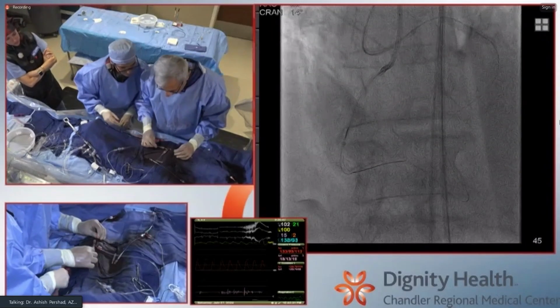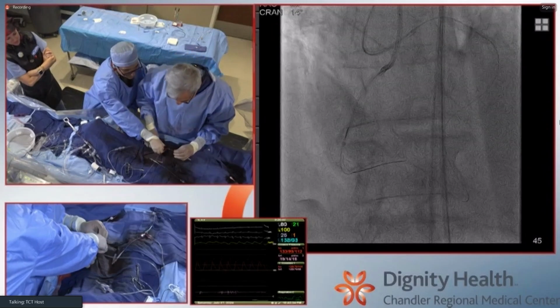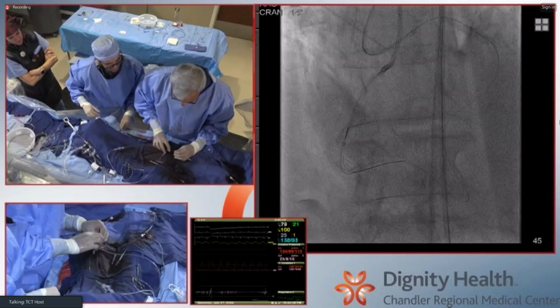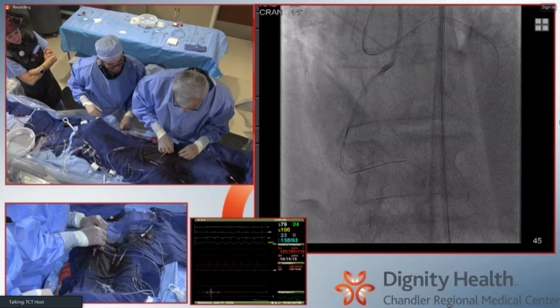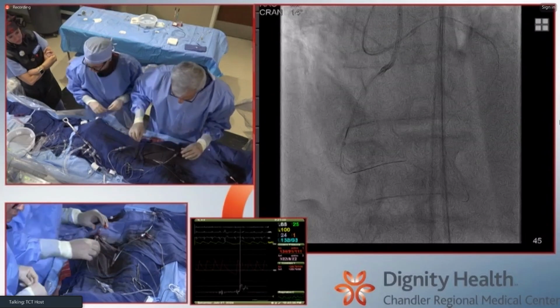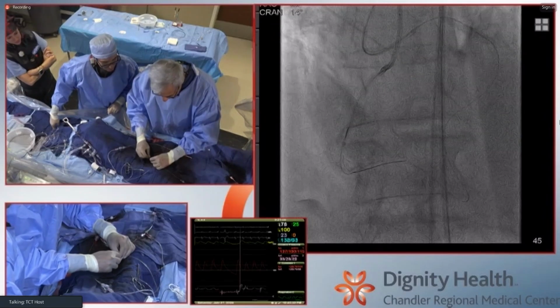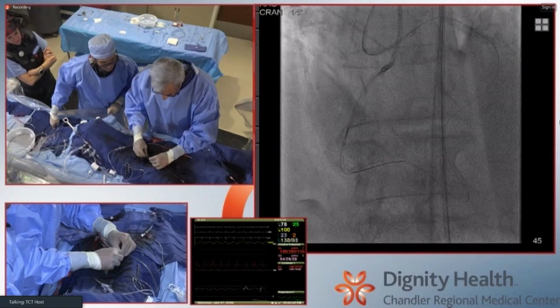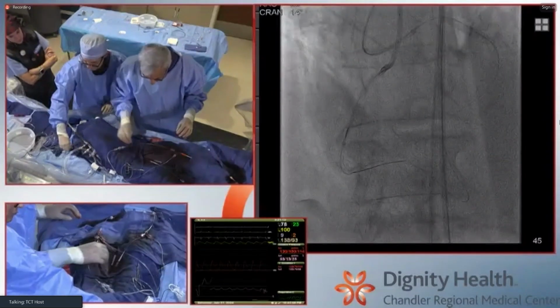Exactly. Thanks, Ajay. Clamping can work, so come on. I mean, everybody likes tricks, but the position's so good right now. Thanks, Ajay. I wasn't doing that. Oh, ye of little faith. You're going to have to take that out in order to get an IVUS in anyway. You're going to have to balloon it, take it out, and probably rota through it, right? So that's coming out one way or another. But not now. He's good now. He's externalized. He has a fellow-proof rail right now.